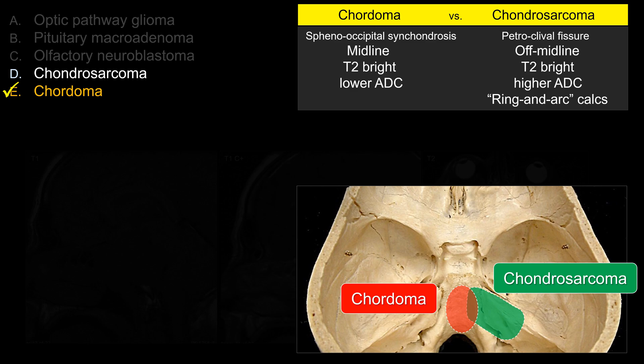Another buzzword description for the board exam: the classic ring-and-arc calcification. That is pretty good for chondrosarcoma. So the key takeaways are: chordoma is midline, chondrosarcoma is off midline, both are bright on T2, and chondrosarcoma on CT shows this ring-and-arc calcification.